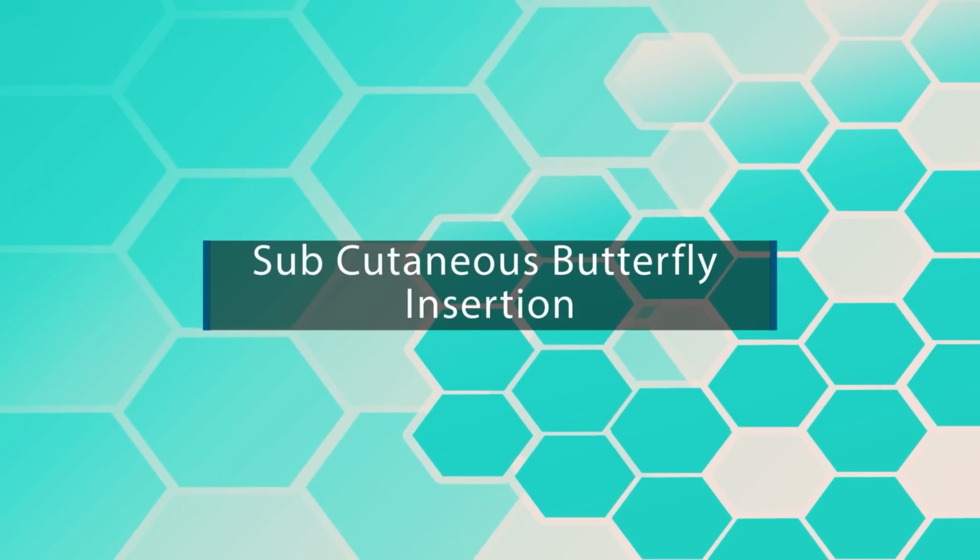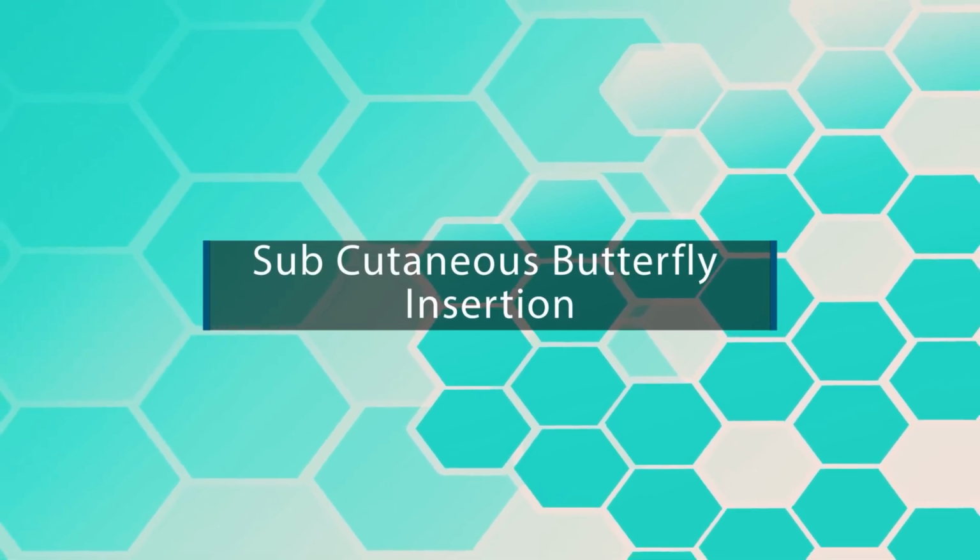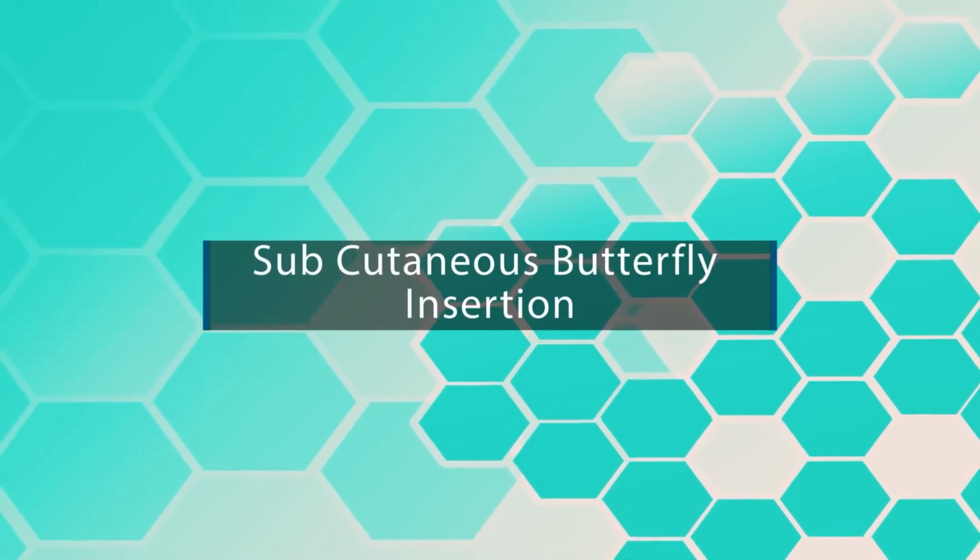In this video, we will learn about subcutaneous butterfly insertion. This can be an interesting procedure for internationally educated nurses and nursing students. Let's learn about it first.